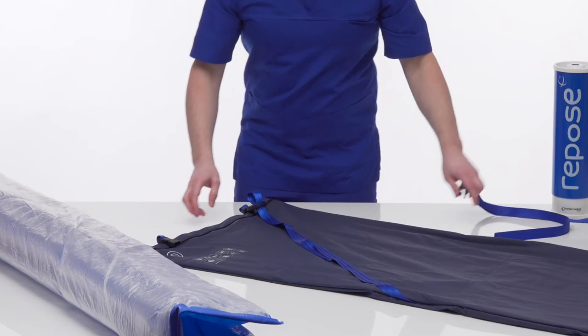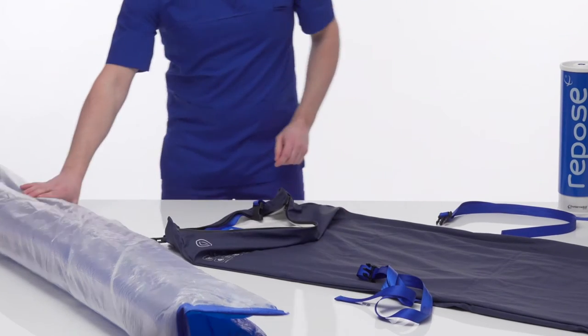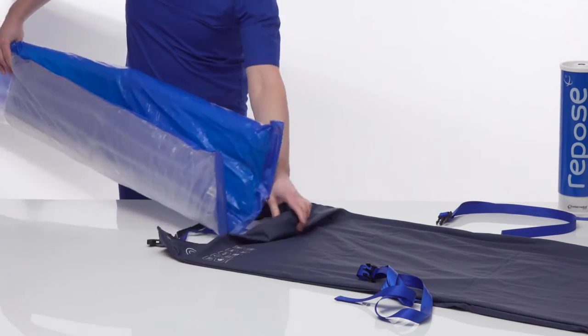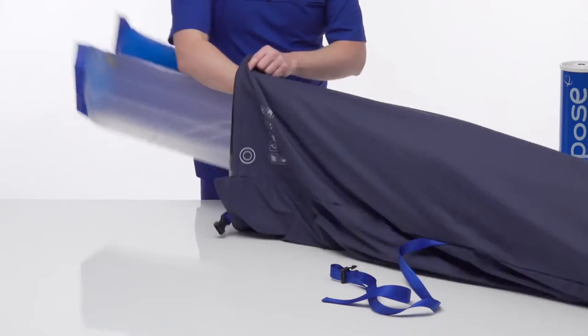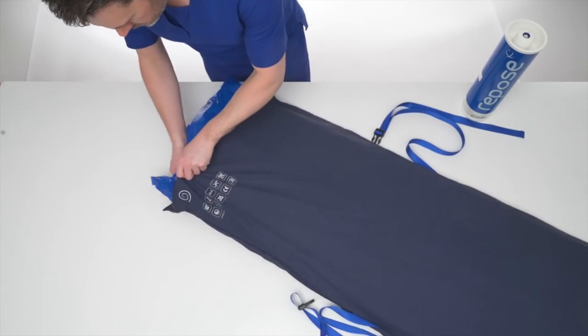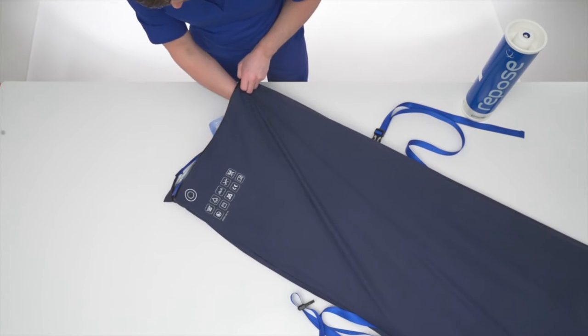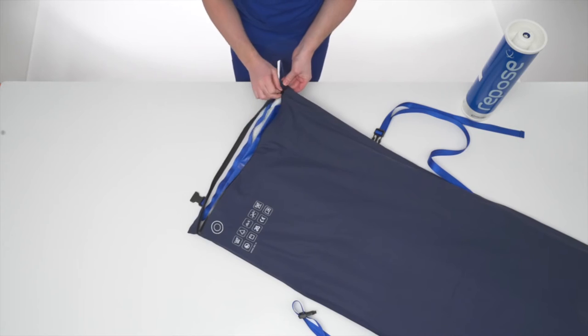Lay the Contour cover out with the zip side face-up. Fold the Repose Contour inflatable section lengthways. Insert into the Contour cover and lay flat with the blue side face-up and the valve at the head end. Close the zip at both ends of the Contour cover.